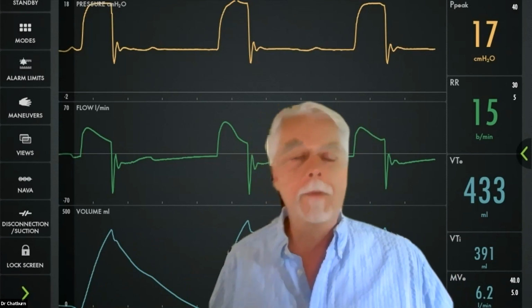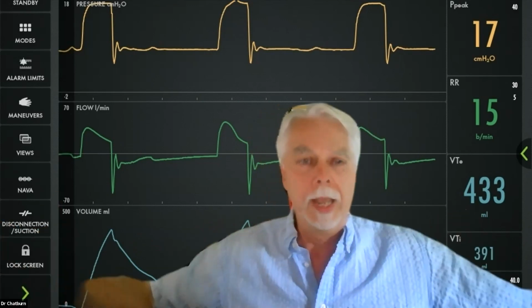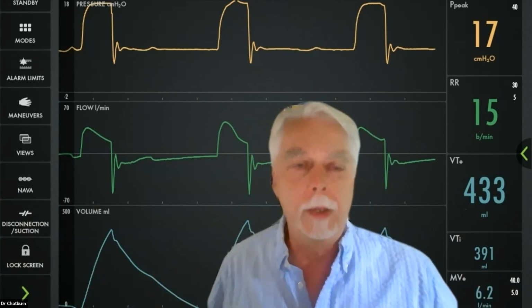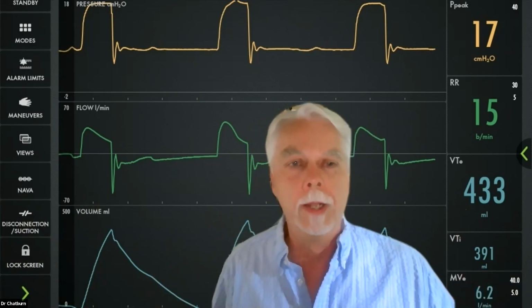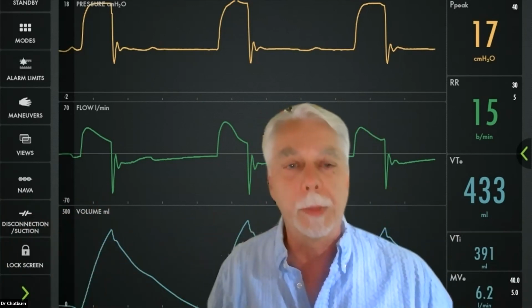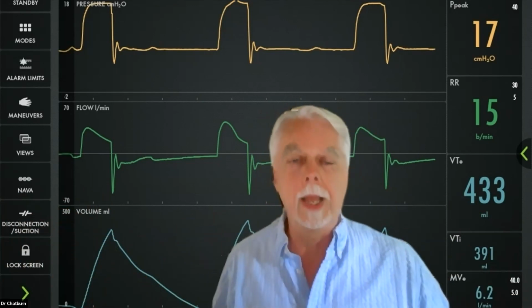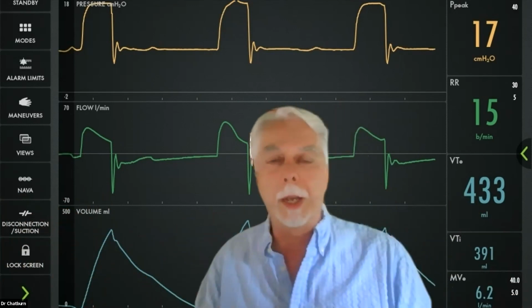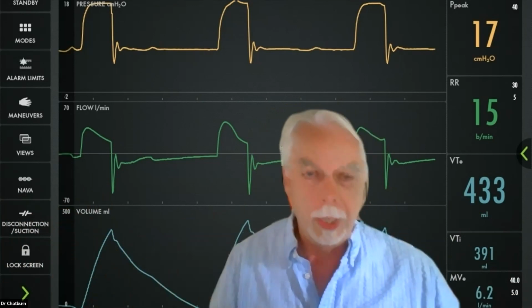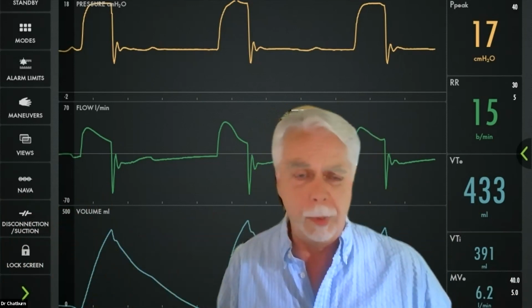And it's never going to be like breathing in from the atmosphere, which has an infinite capacity to provide you with the flow that you want. If you have to suck the flow out of some kind of box, there's always going to be some delay. But ideally, you want to keep that delay, both in terms of triggering and cycling and peak flow. You want those delays and phase shifts to be as minimal as possible.